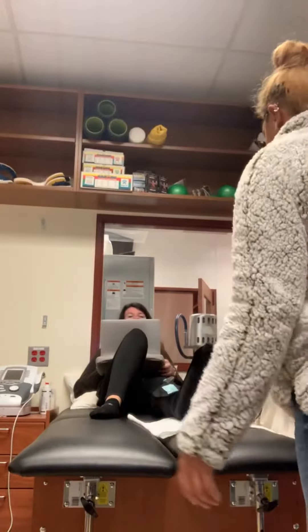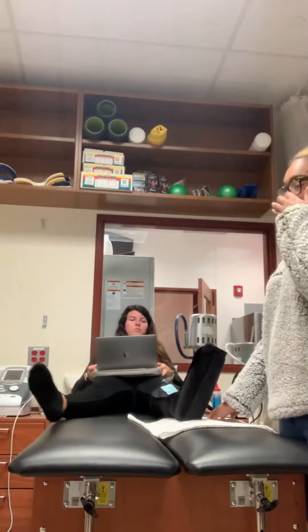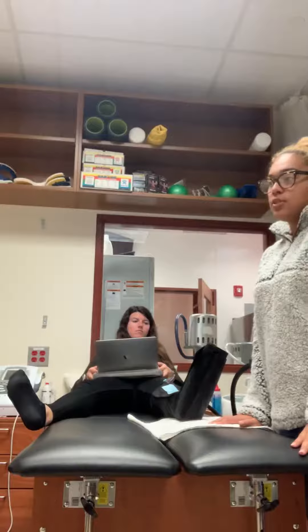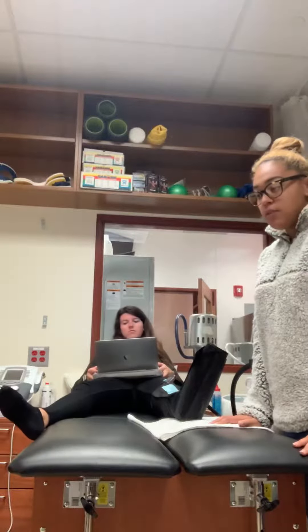Today we have Taylor set up on GameReady for the lower leg and ankle. GameReady is intermittent cold compression. We're going to use it to help reduce swelling, help manage pain, and to prevent further swelling.